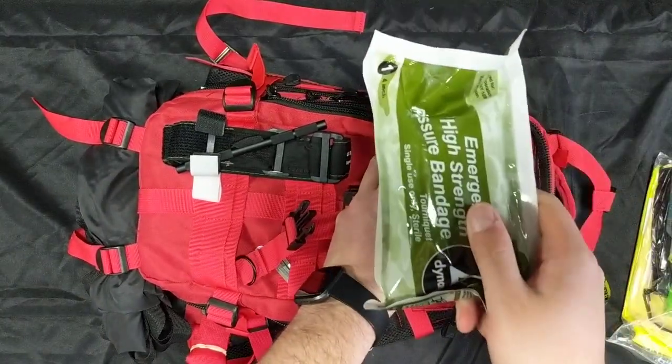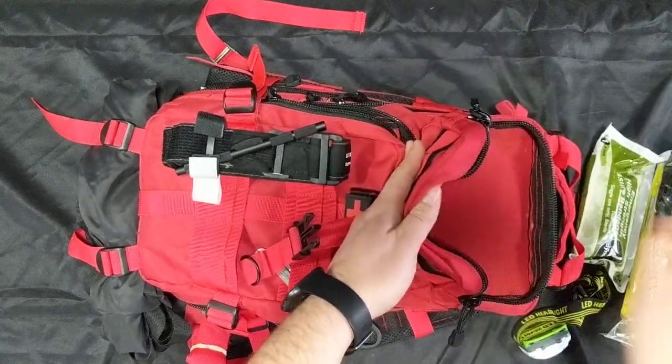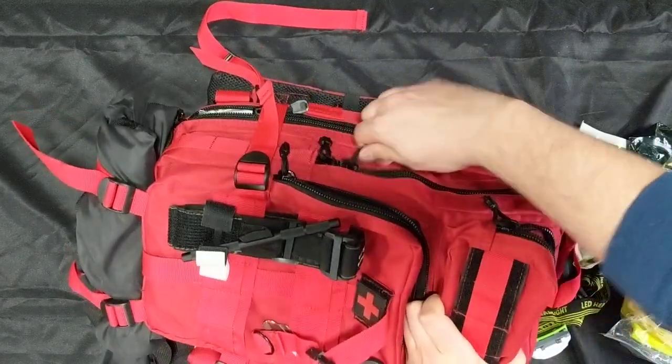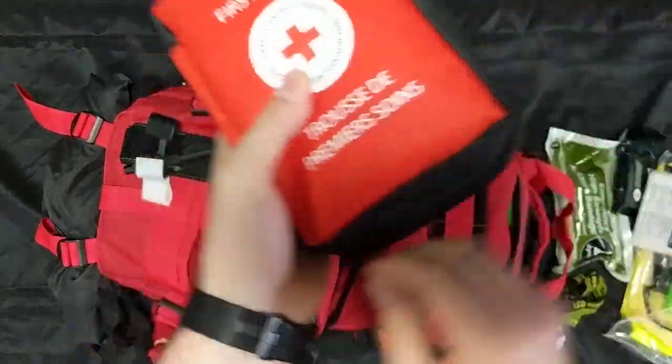Our top pouch has extra bleeding accessories: an Israeli-type bandage, compressed gauze for wound packing, and a compressed bandage for slightly bigger bleeds. Then our first major pouch has a wound kit.